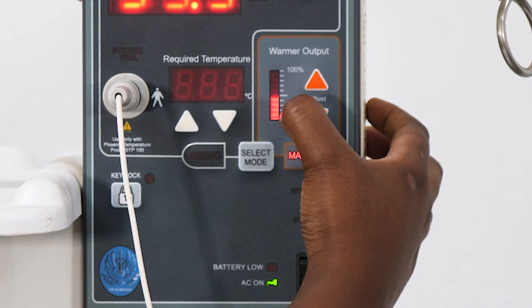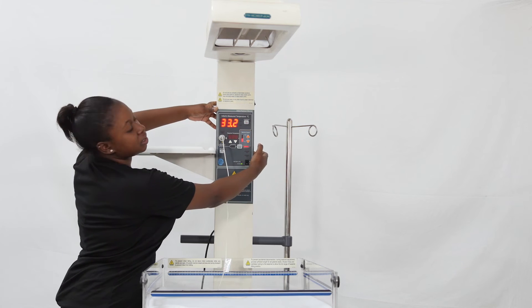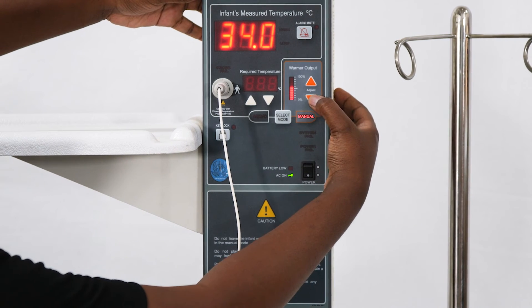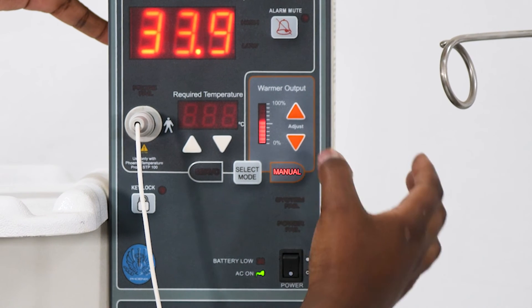The output levels go from 0%, 10%, 20%, 30%, 40%, 50%. You adjust the output level with the red buttons — the up arrow and the down arrow — to increase or reduce the heat. Each step up represents 10%.